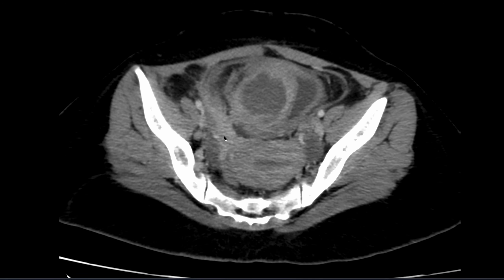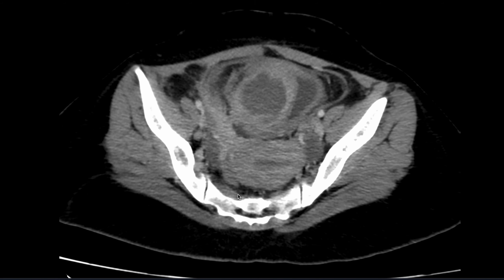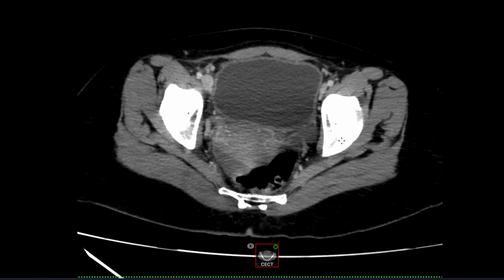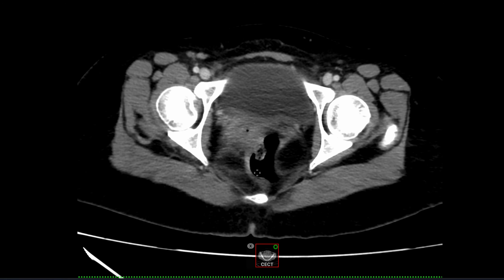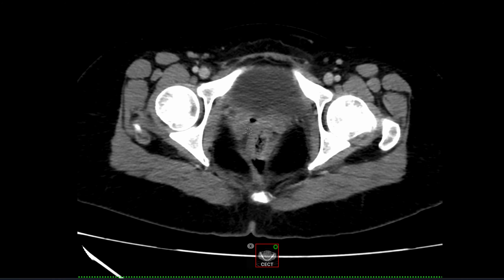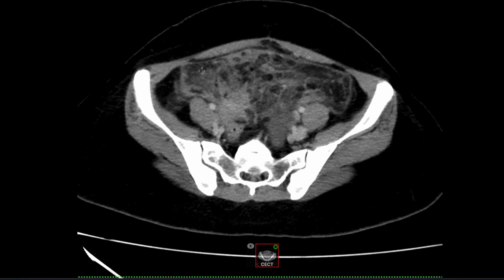Both ovaries are separately visualized. Pelvic collection is anterior to the uterus and also anterior to the right ovary, approximately measuring 5.18 to 4.9 centimeters. A thin rim of fluid is noted in the POD, which is posterior to the vagina. Severe inflammatory changes are noted in the bilateral iliac fossa.